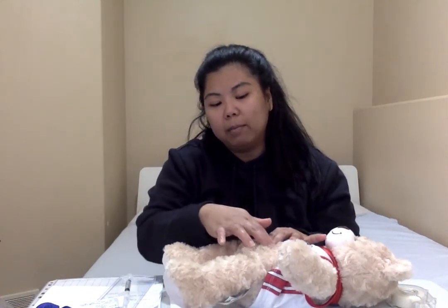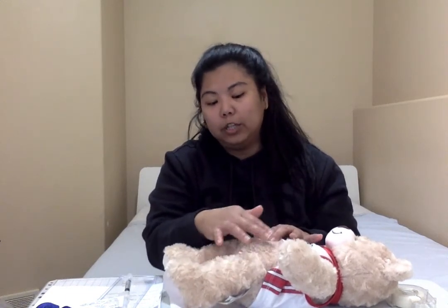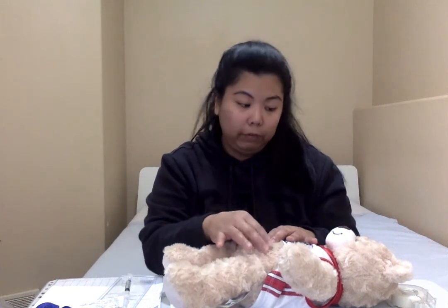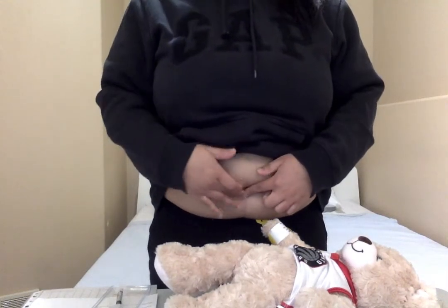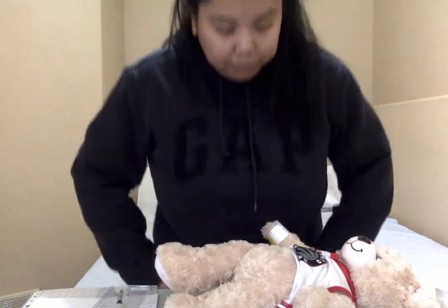Thank you. So for landmarking, we're going to use the patient's umbilicus. So this is my patient's umbilicus, and then I'm going to go 5 centimeters away from it. And then this will be my injection site. And if you're giving multiple doses of this medication, let's say Jake needs another one later on in the day, then we want to rotate the injection sites. So just to show my landmarking, this is my umbilicus. Then I'm going to go about 5 centimeters from my umbilicus, so this will be a good injection site.